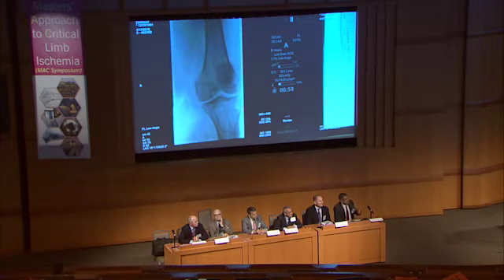I agree, and I'm just going to say my point of view and then let the panel discuss. I think you're absolutely right, but here the question is not an all-or-none phenomenon, but more the relative nature. So my personal view of this angiogram is that the predominance of this AV fistulous connection is coming from the profunda. It certainly does not mean that there are none other.